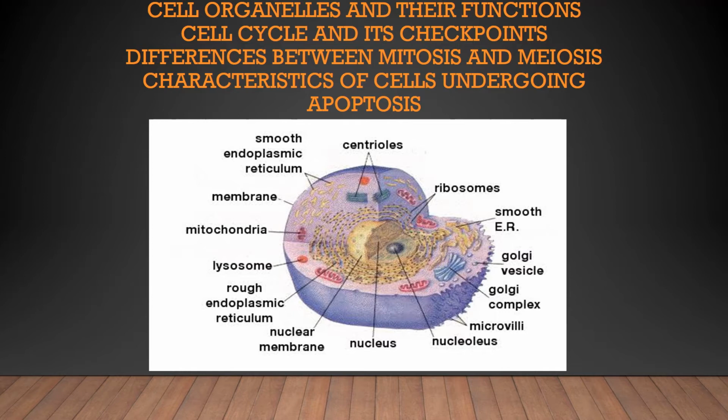So another question which may be asked in relation to this includes something like features of protein synthesizing cells. So this would be like abundant ribosomes, an extensive rough endoplasmic network, and also an extensive network of Golgi vesicles, and abundant mitochondria, and so on. So also, I guess the last thing I want to talk about is the cytoskeleton components, which you may be asked, and they're basically microtubules, microfilaments, and intermediate filaments.